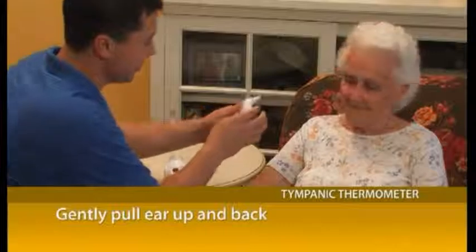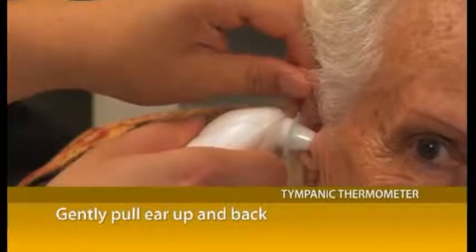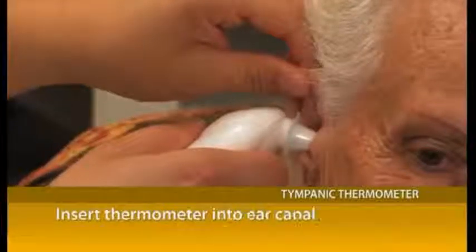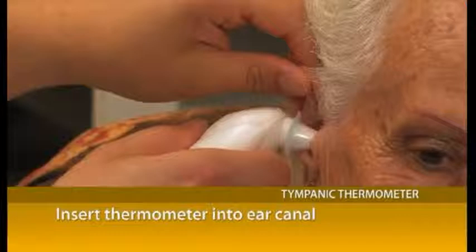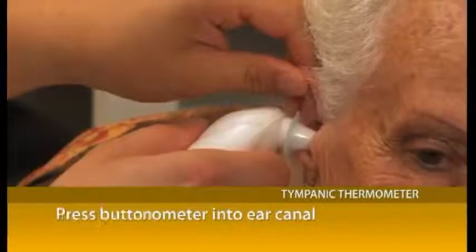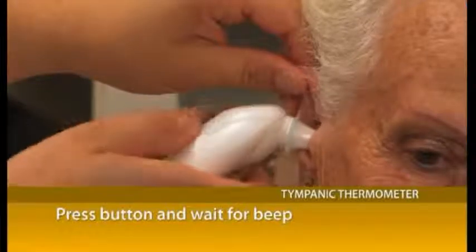When measuring an adult's temperature, gently pull the ear up and then back. Put the covered tip into the ear opening. Do not use force or push hard. Press the button to turn on the thermometer. Hold the button until the thermometer beeps.